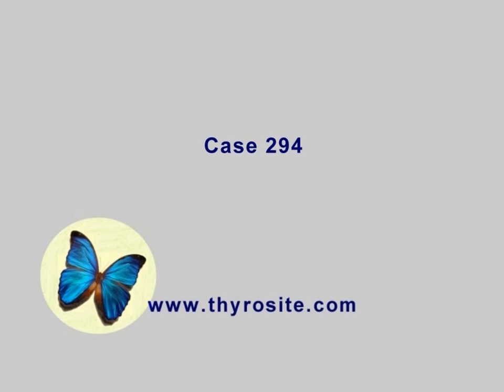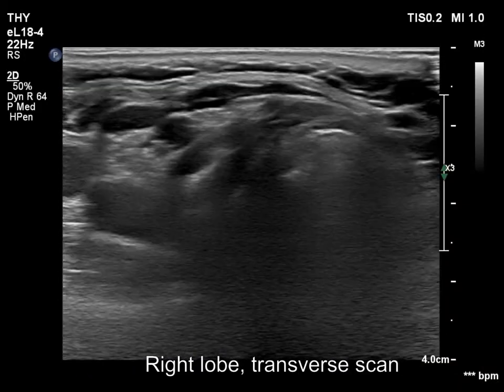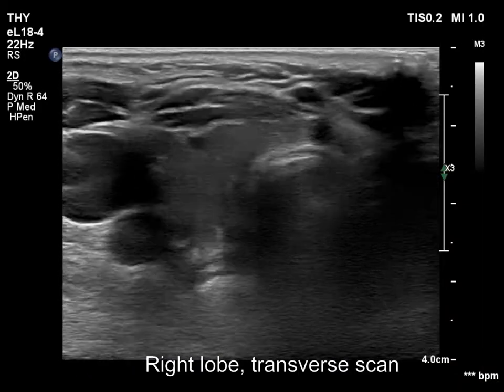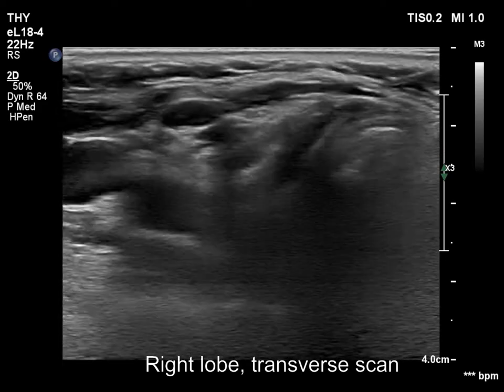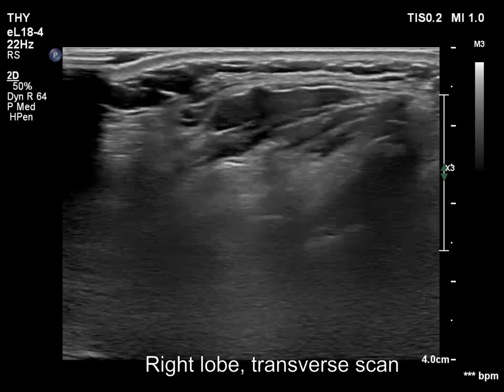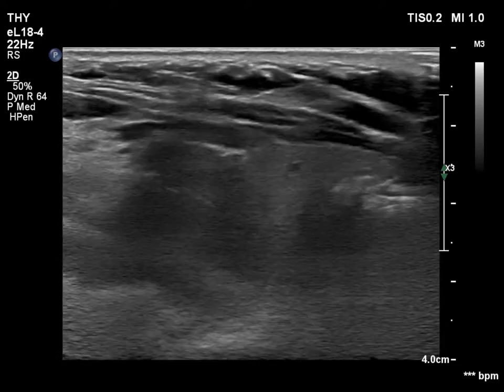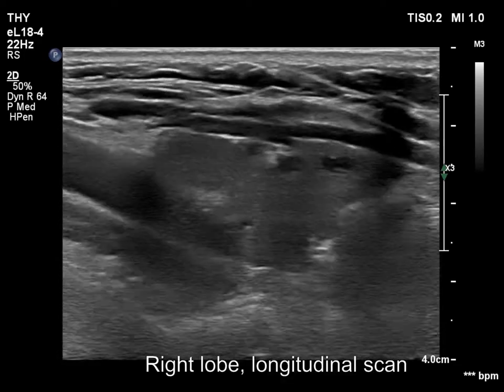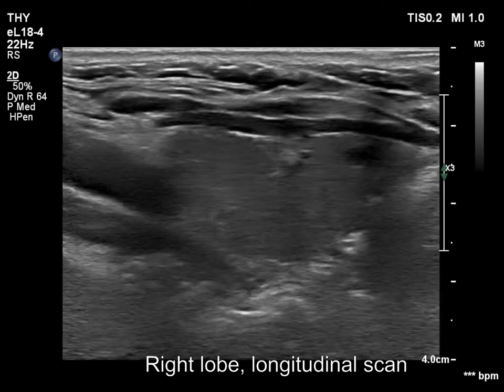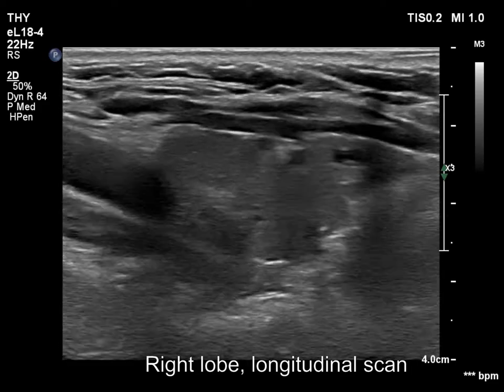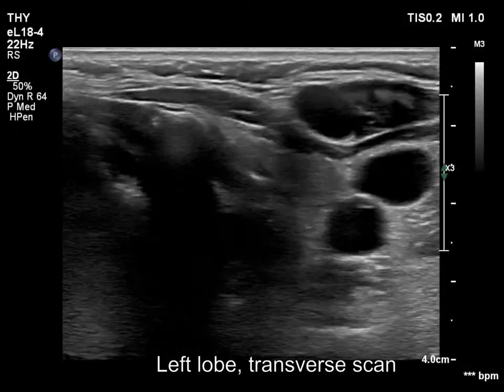The right lobe is minimally hypoechoic. Considering the age of the patient and the normal ATPO level, the decreased echogenicity is due to aging. There are tiny cystic areas within the lobe. These should not be regarded as pathological findings, as they correspond to dilated macrofollicles.